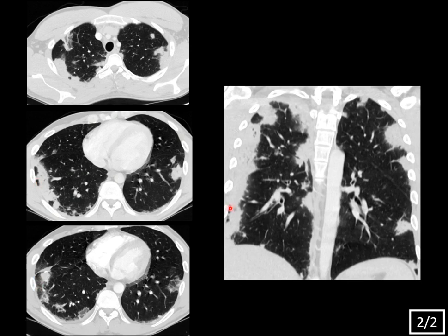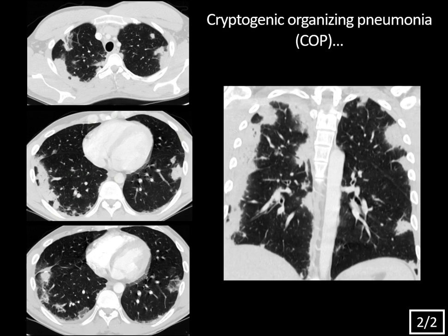The consolidations almost look like they're being peeled off the pleura, with some panlobular sparing at the right lung apex. There are also a few ill-defined nodular densities scattered throughout the lungs. Notice areas with central ground glass opacity and surrounding increased density — giving a reverse halo appearance. These findings are typical for COP, or cryptogenic organizing pneumonia, formerly known as BOOP (bronchiolitis obliterans organizing pneumonia). The name was changed in part due to confusion with bronchiolitis obliterans, which is unrelated. COP is thought to be a reaction of the lungs to injury, where granulation plugs form in the alveolar ducts, leading to surrounding inflammatory change.